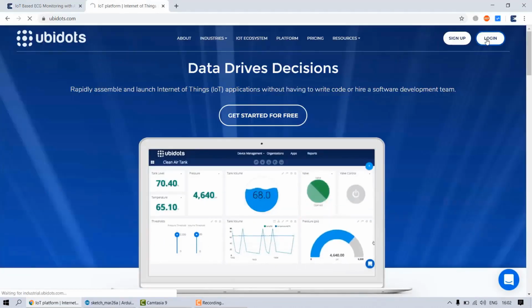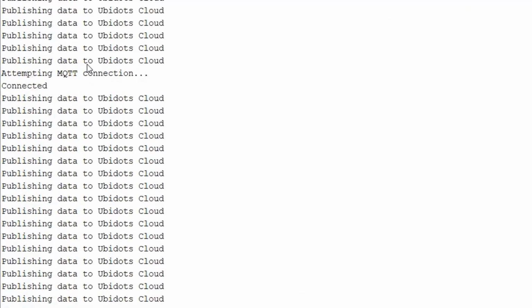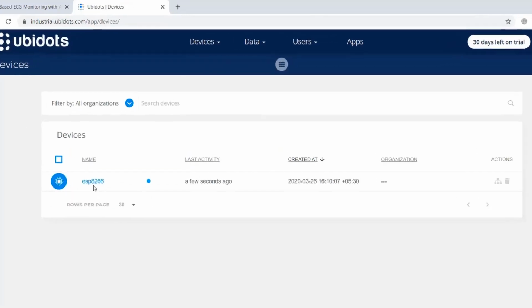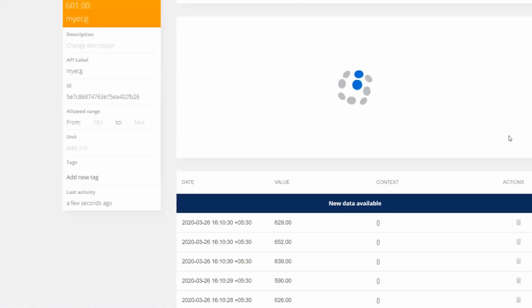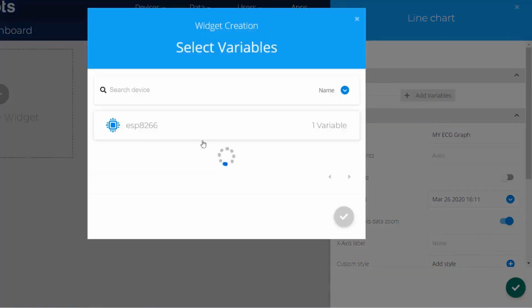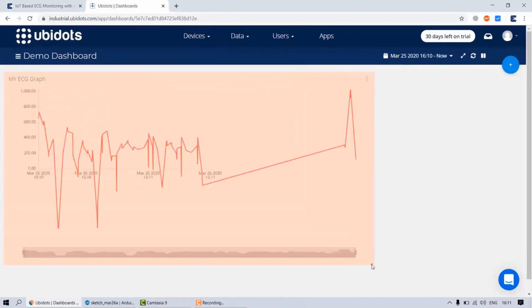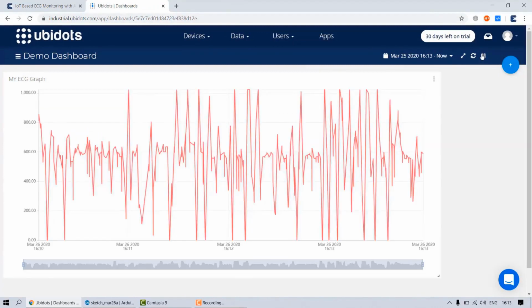Similarly, we'll use an IoT platform called Ubidots, where we'll use the MQTT protocol to send the data over the cloud. And then we'll simply monitor the ECG of a person online using the AD8232 ECG sensor. So in the Ubidots dashboard, we can simply monitor the ECG of a person online from any part of the world. So let's get started.